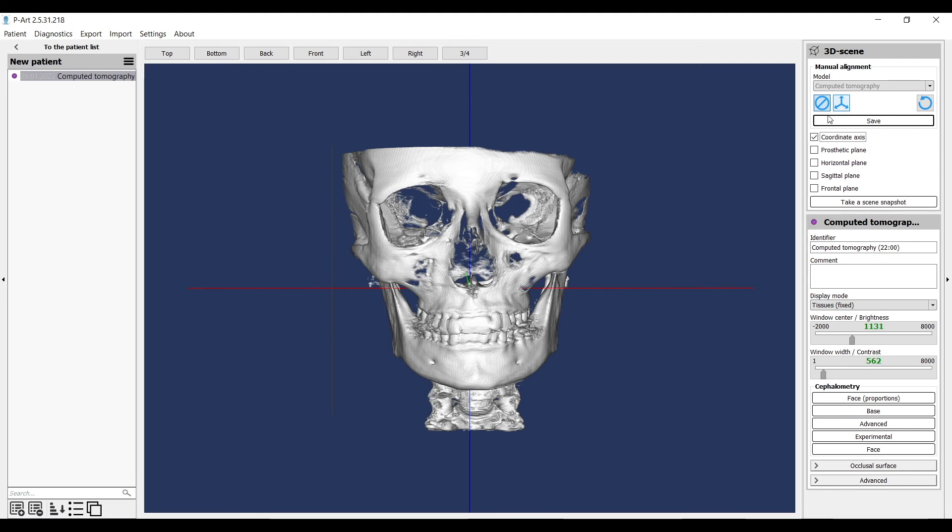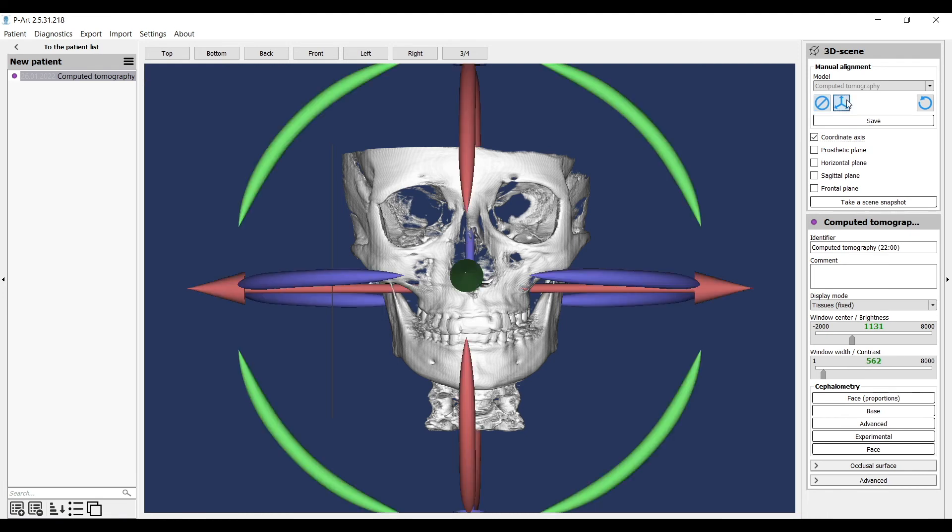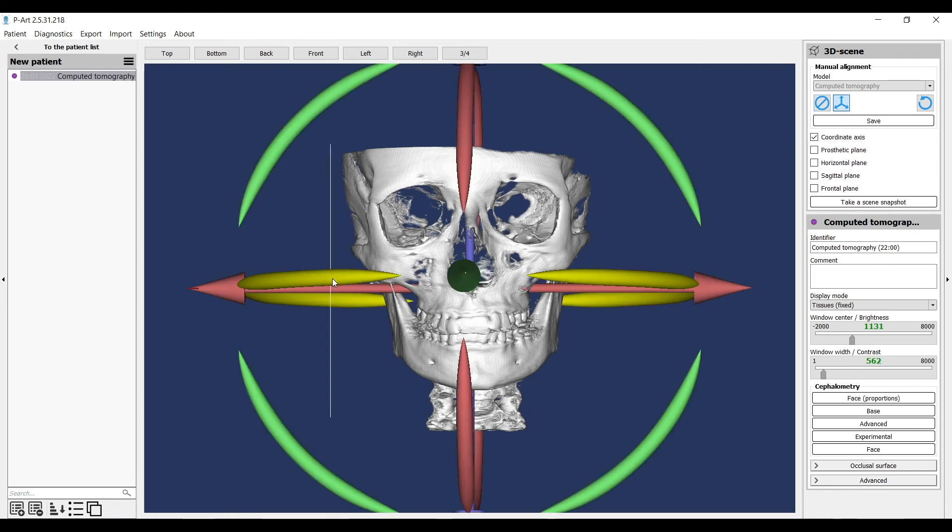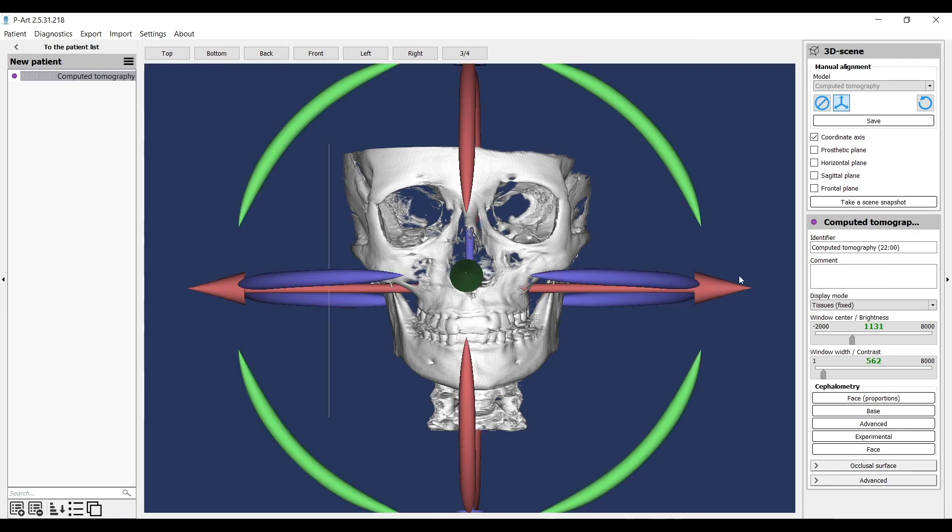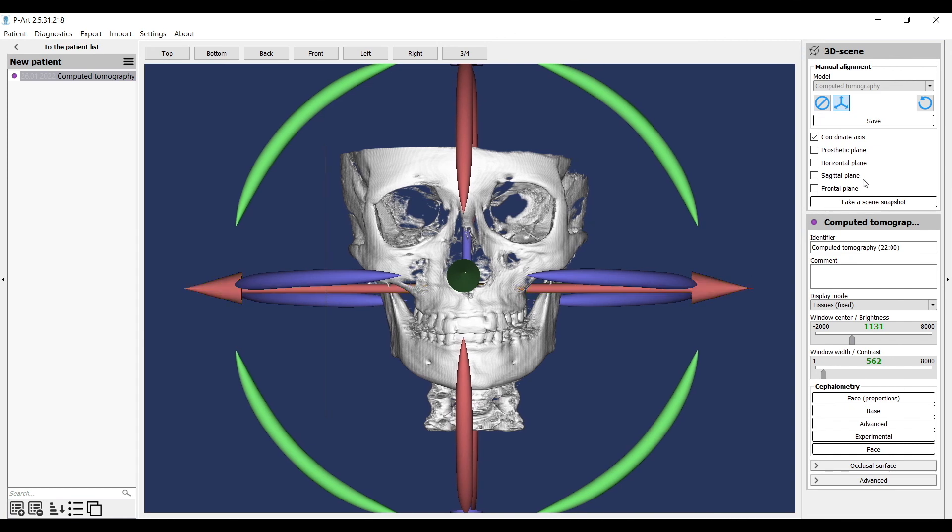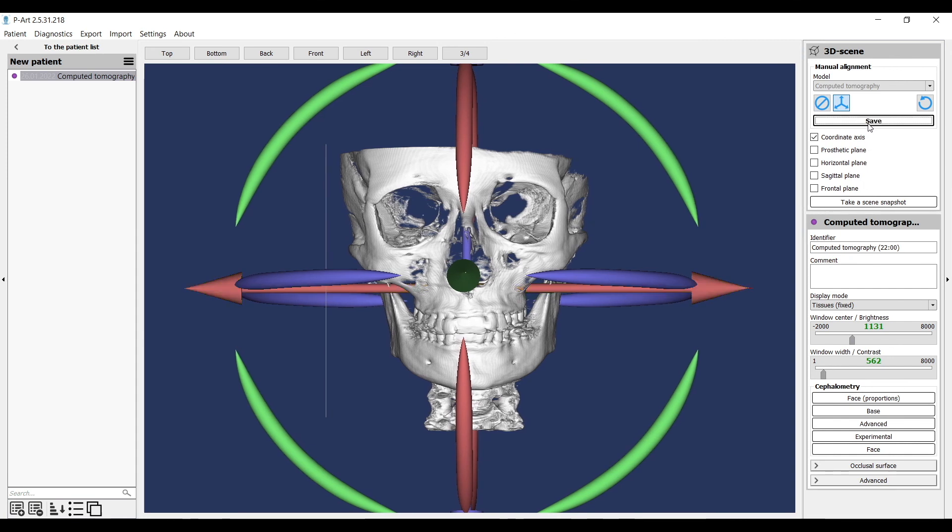Turn on Manipulator and turn the tomography a little bit to place it more centered. Then save it.